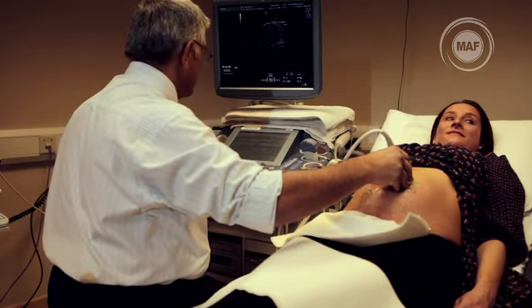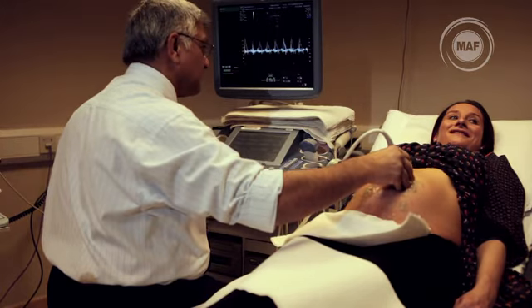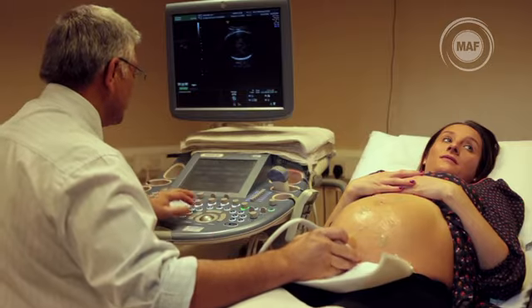That's the baby's heartbeat. Would you like to hear the heartbeat? Yeah, okay. Thank you. So you can see the head right down. So the head is down in the cephalic position.